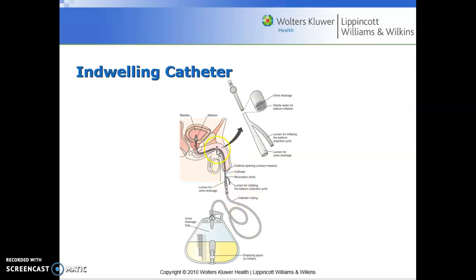We did not go over in lab how to insert a Foley on a male patient, and I will do that with you. I will make sure that you understand and you're comfortable with catheterizing a male patient as well. It's the same technique, but you do have the prostate to contend with, and that can be very challenging.